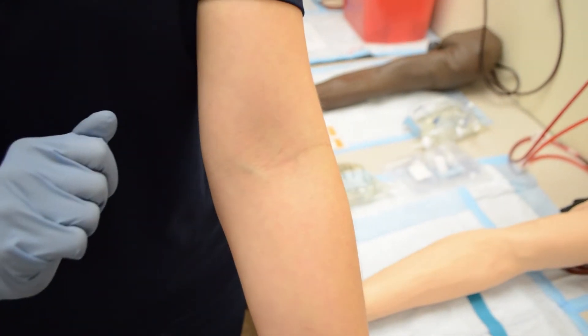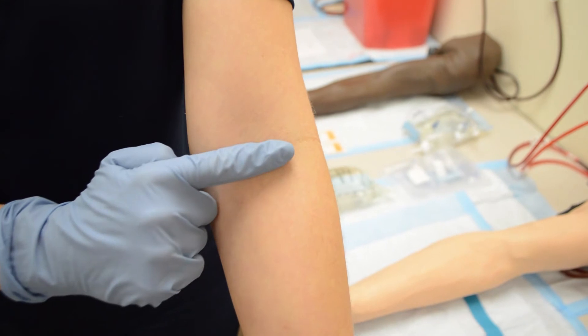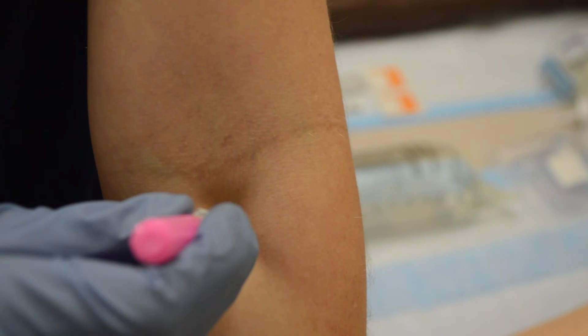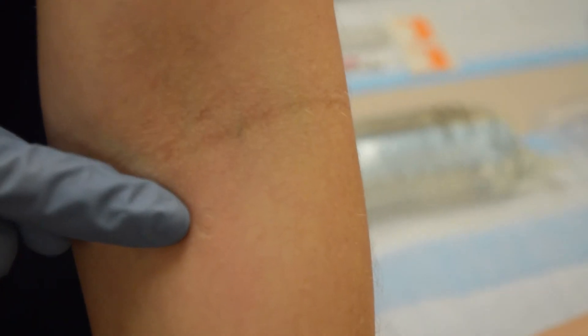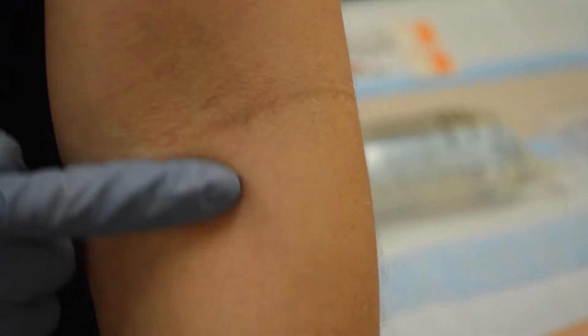Sometimes veins that we cannot see but we can feel — we lose them after cleaning. So before you clean the site, you can use anything with any kind of depression in it. Lightly press it up against the skin and rotate back and forth where you've found the best place to poke your patient. When you remove it, you'll have a small raised area that you can clean and it will still stay there, and you can use that as a target to aim for.